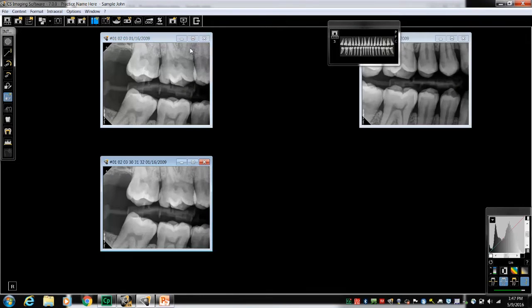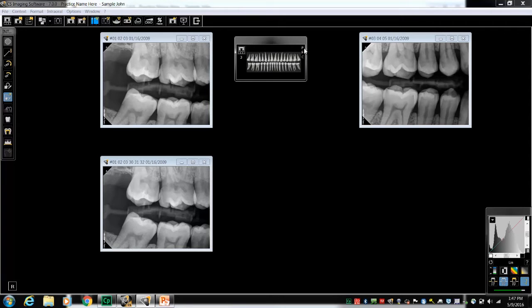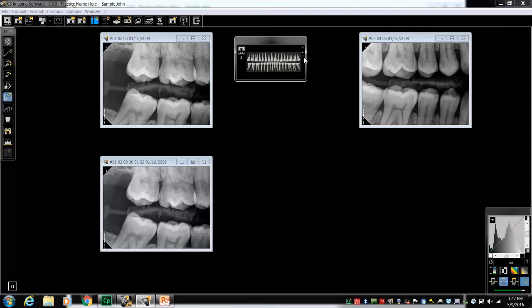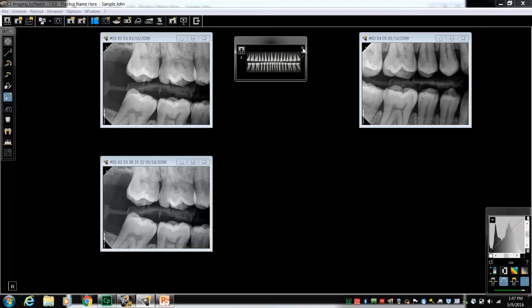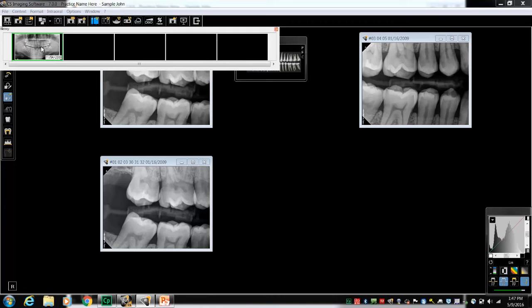Additionally, there's a modality filter. The letters P represent images that were taken with a CareStream panoramic machine, F represents images saved in a format, and C represents images acquired from a CareStream cephalometric unit. Selecting one of the modality letters will reveal all images of that type, and you can open them from the history the same way. Single left-click to select images, double left-click to open.